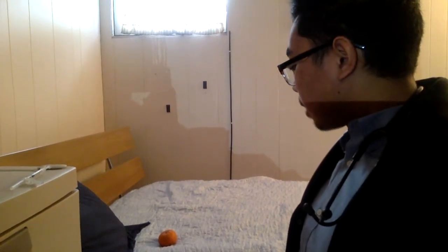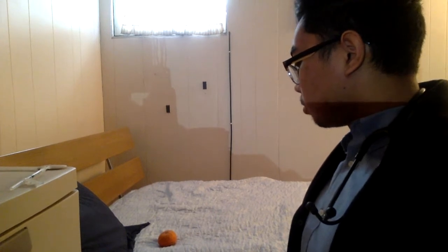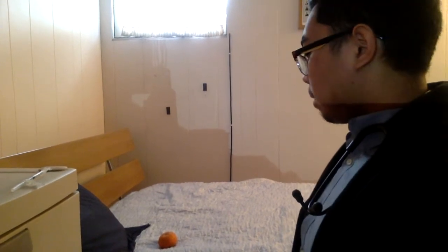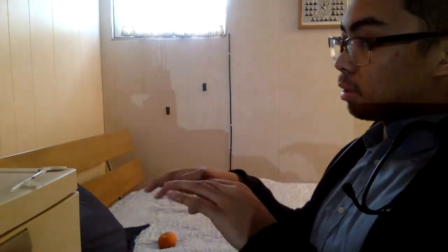Okay, so now what I'm going to do, I'm going to close the curtain. While closing the curtain, I'm going to make sure I keep my eyes on the medication at all times for safety purposes. And now I'm going to do my last check of the medication. I'm going to check the EHR or even MAR on my rolling cart. I'm going to make sure that this is the right medication for this patient.